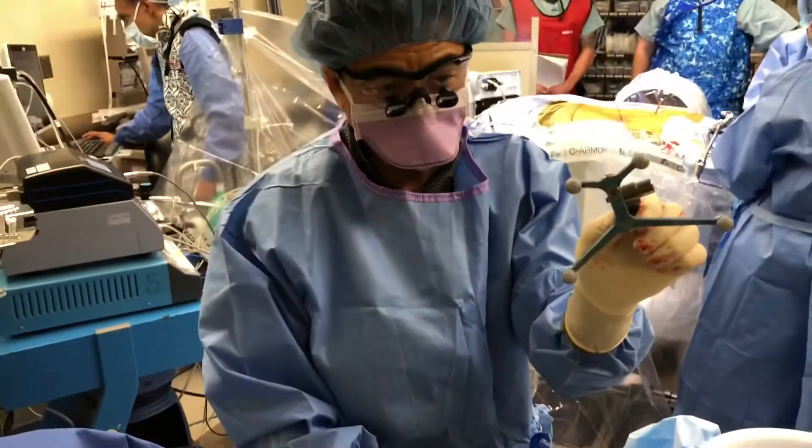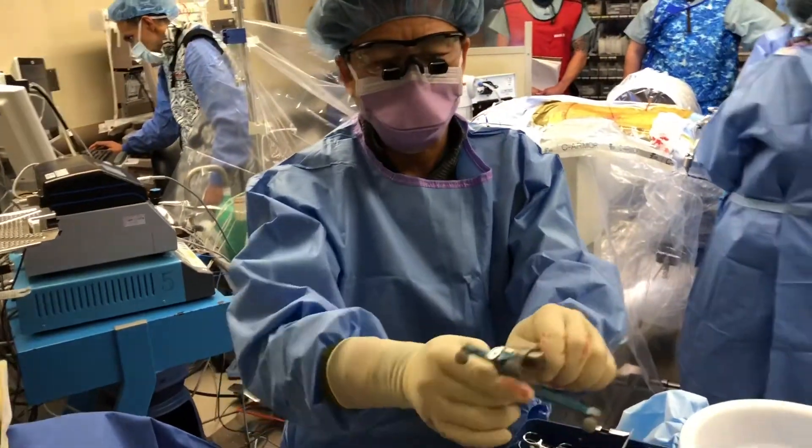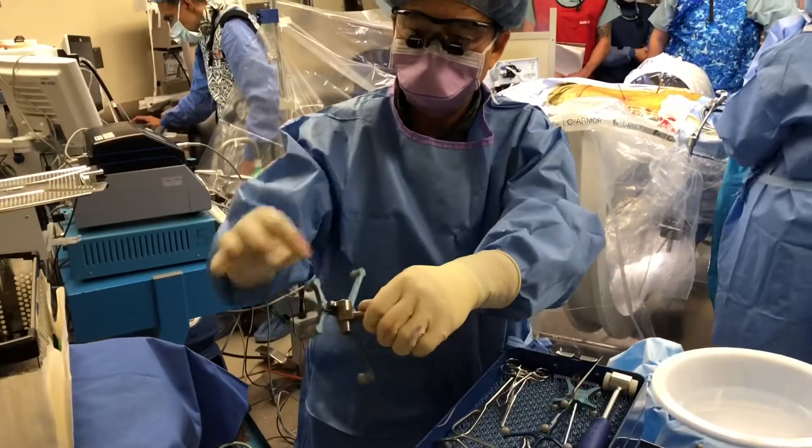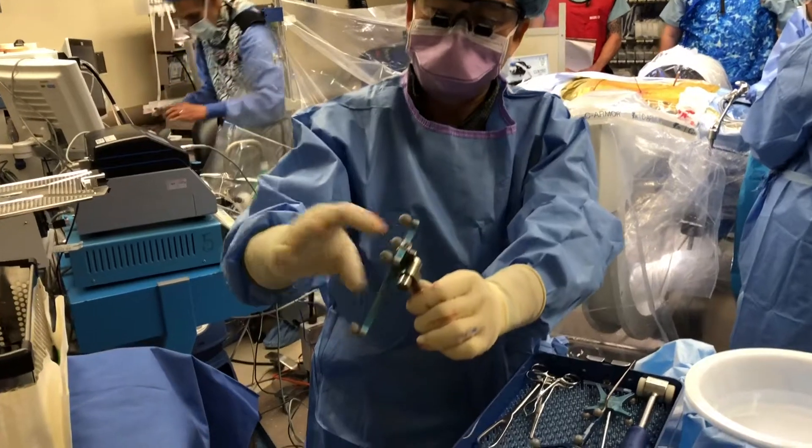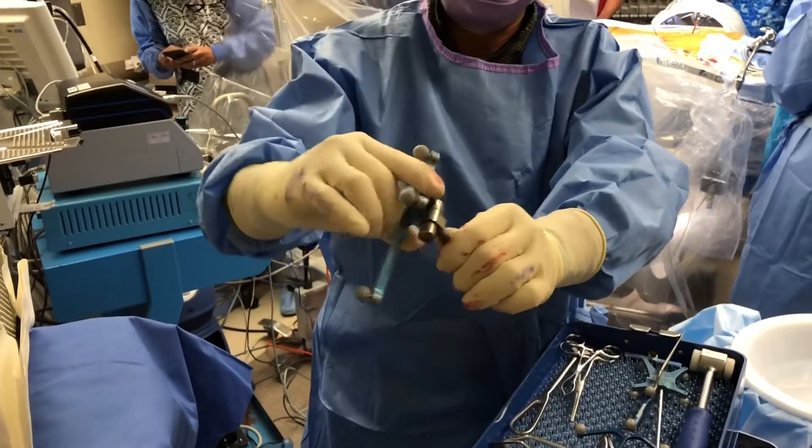This is the patient reference frame. It sits on this bumpable frame. You can see — I don't know if you can see these teeth right here — but once this is set, there's a spring-loaded device.